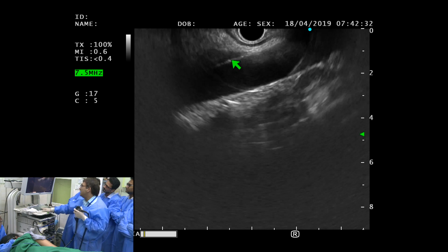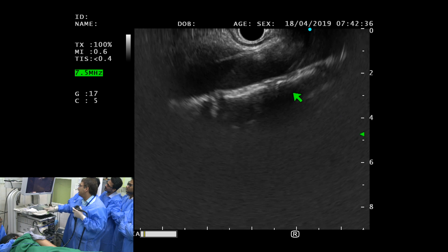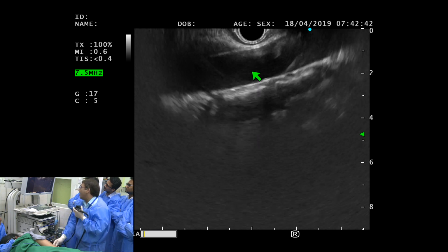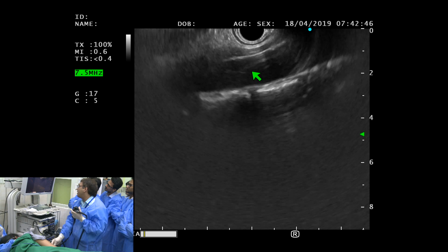Aorta position should be like this. It's a nice soft landing of the plane. It shouldn't be in this direction. It shouldn't be completely flat. And so after you find the aorta, you just gently advance the scope with the right hand.